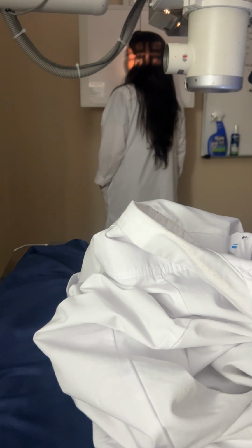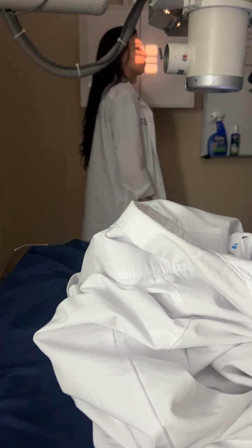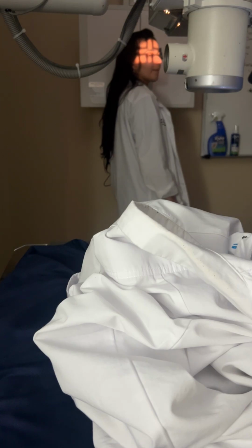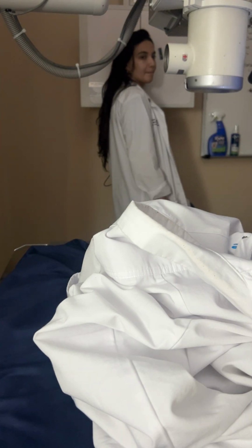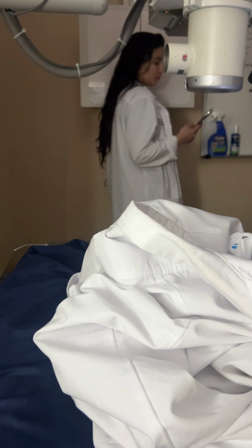Questions on the Reese method? Luckily, it's just those two if you get the Reese method. You remember the three-point landing? Not bad. And then you said right and left. Right and left orbit, okay? So it's not the side touching the board, it's the one. It is. The side down or side touching the board is the one of interest. Okay. Just making sure.